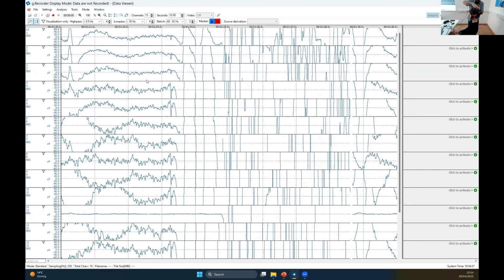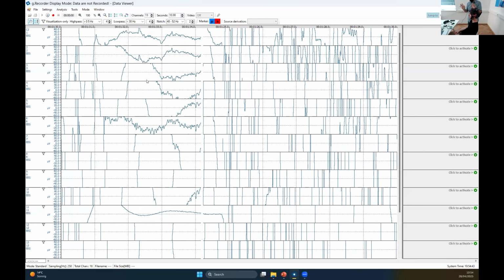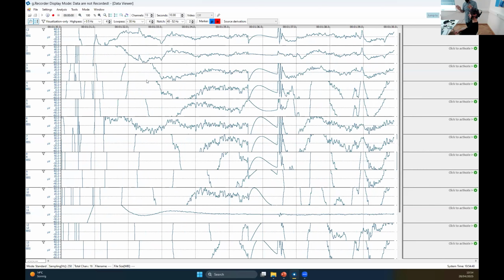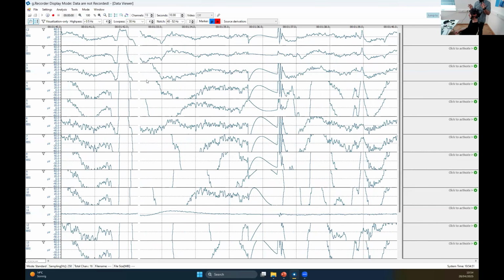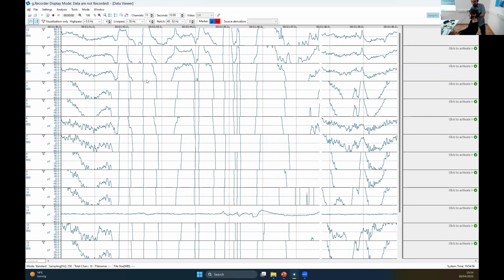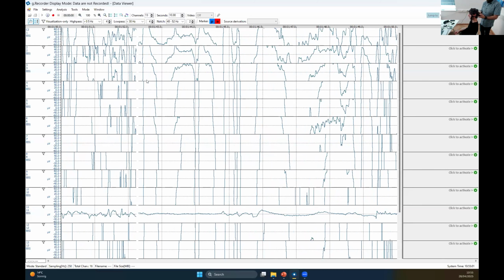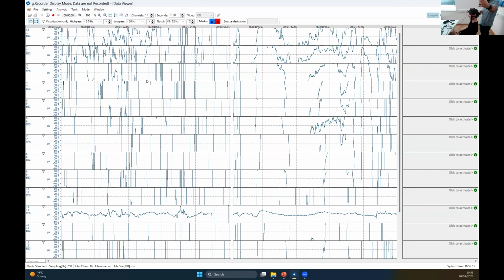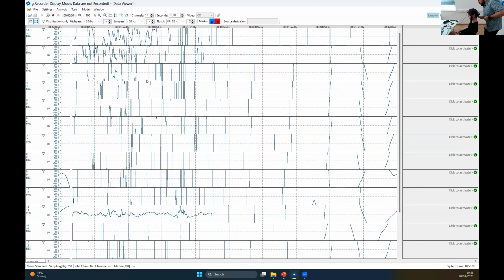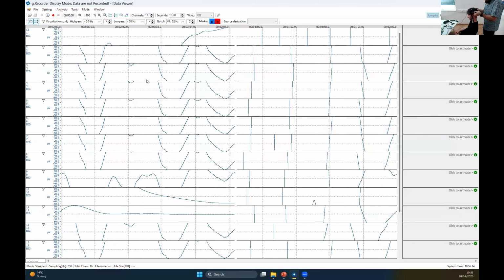Yeah, so you can see very easy to set up. So you don't need to put much effort into it, and the signal is already applied and recorded without needing any extra application of gel or anything. Quickly, 4 minutes, just let's switch the cap, but not the amplifier. So the amplifier remains the same. It's this one. We will take the cap, the passive, the dry cap from Matthias, and we will now start to make him wet.